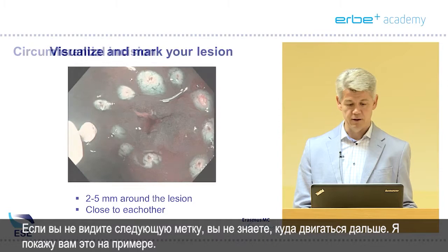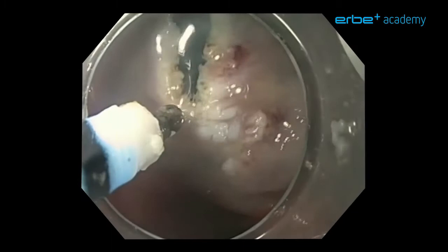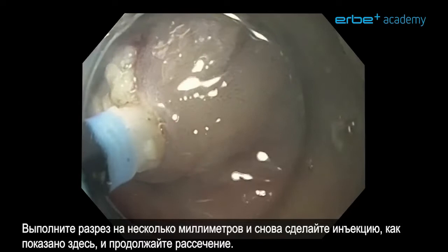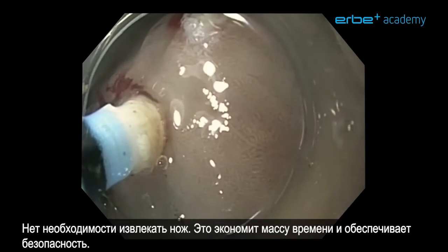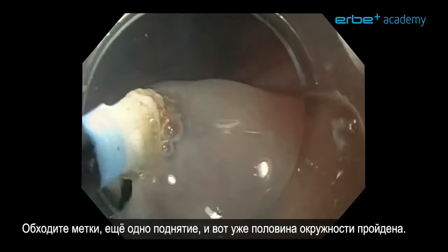I'll show you in this example. We do this part of the circumferential incision, and at all times you can see two markers. Every time we start with a submucosal injection, and when we see it inject we start cutting — cut for a few millimeters, then inject again, and continue cutting. You can always see two markers so we know exactly where to go. No need to pull out the knife — this saves a lot of time and makes it really safe. Go around the markers, another lift, and half of the circumference is already cut.